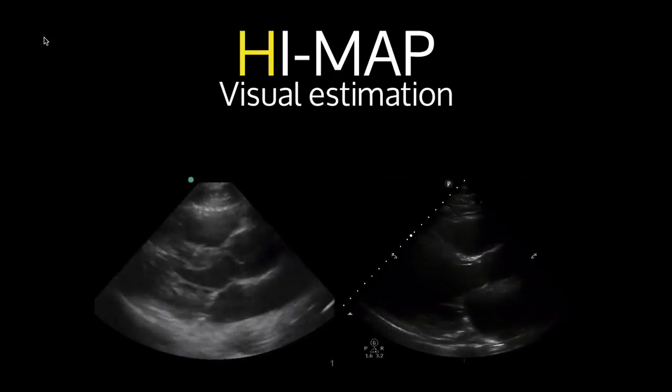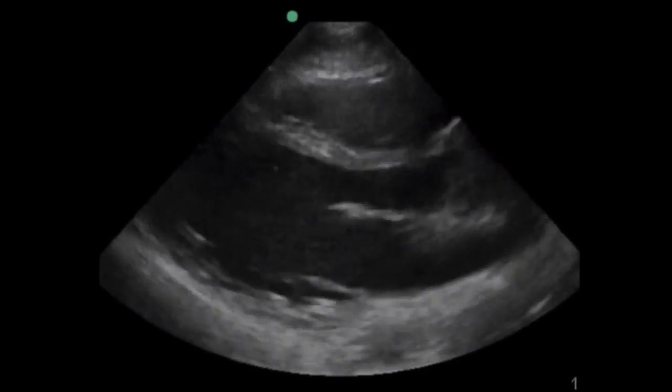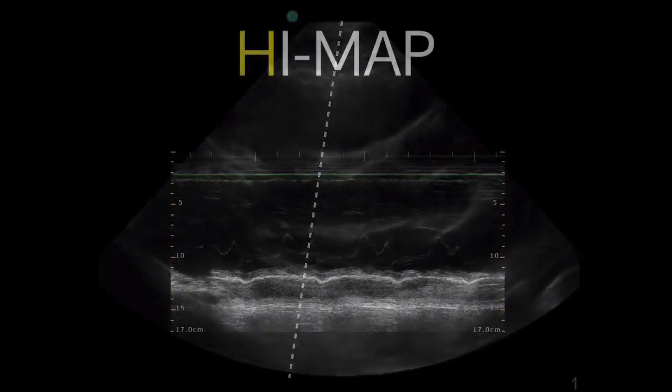Now, if that's something that is a little bit difficult to see, you can always do an EPSS estimation. So when you're doing an EPSS, you want to put the M mode cursor just right over the end of the mitral valve leaflets, right about here. And this is the tracing that you'll get.